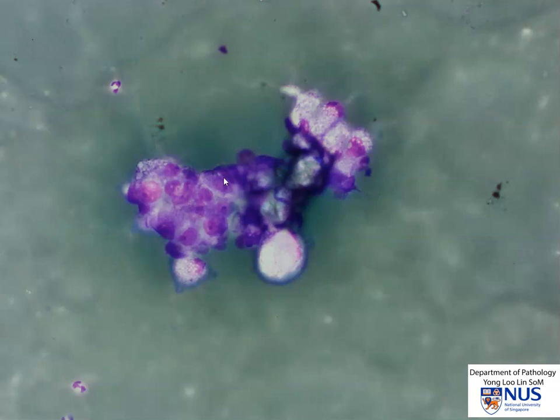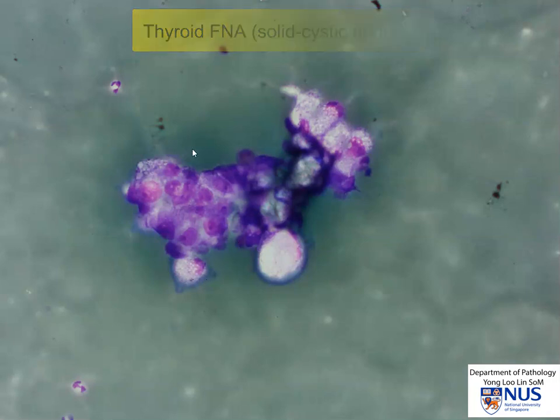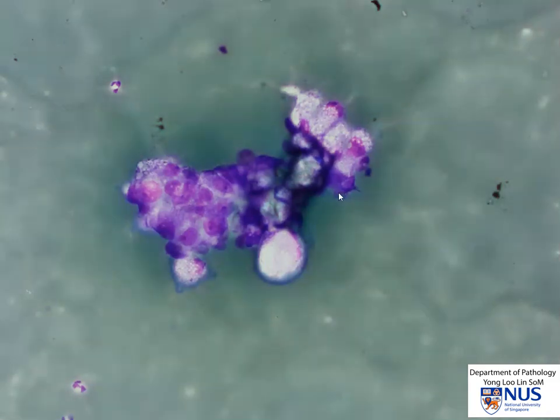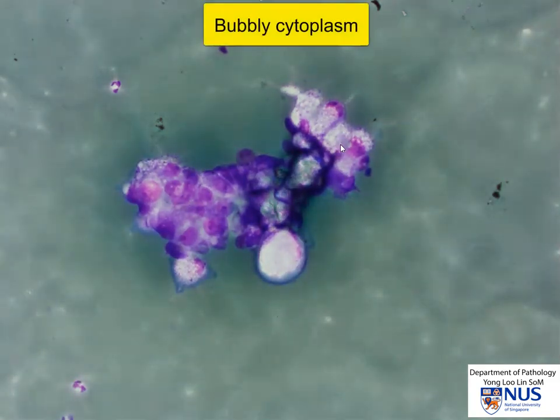Here is an FNA taken from a solid cystic thyroid nodule, and this is the air-dried smear. We can see a rather tight cluster of cells with very bubbly cytoplasm.